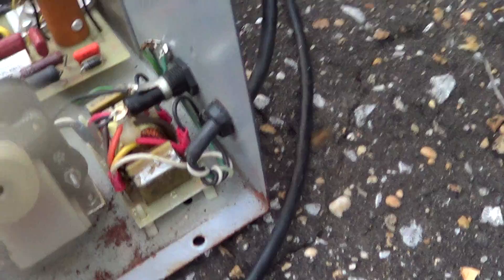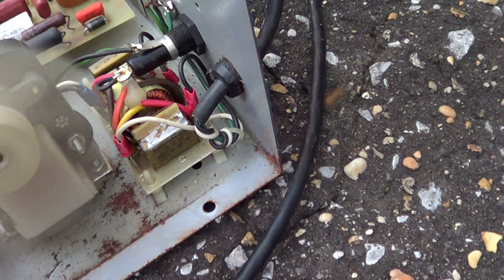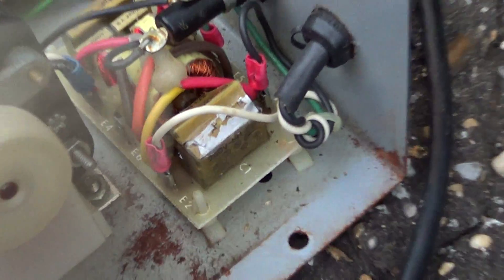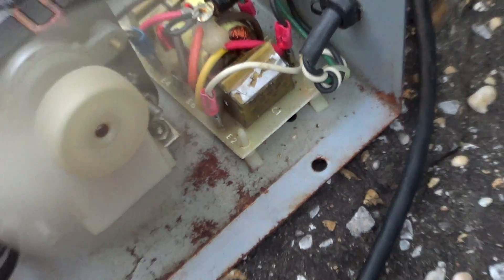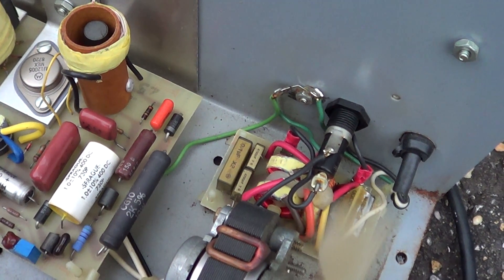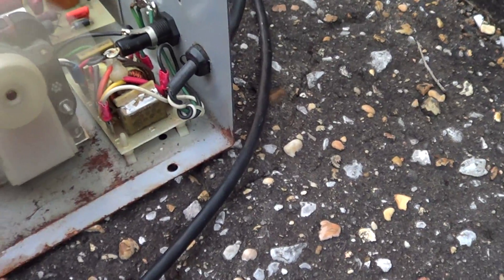Anyway, over here there's a cap, C1 — looks like a filter board. And the top of the capacitor here is popped out, right there. Hopefully that's all that's wrong with it. I'm going to have to figure out what value that is. The one in the center of the screen says 0.1 microfarad XF. This other one looks like it's bigger.